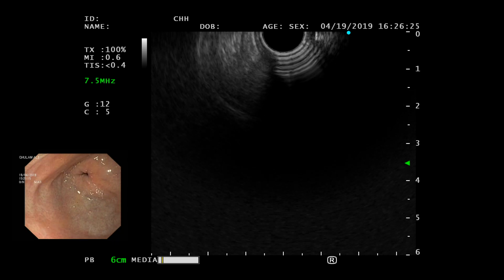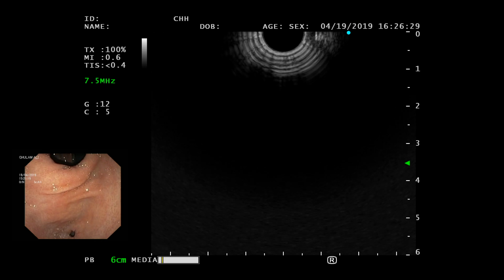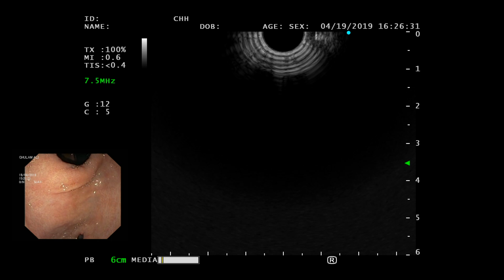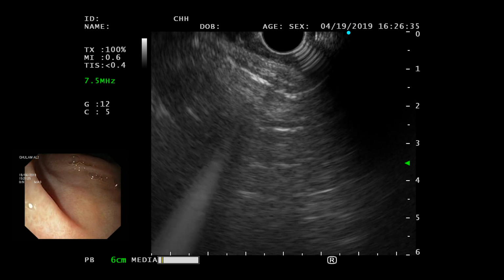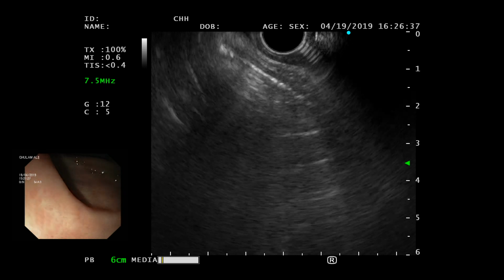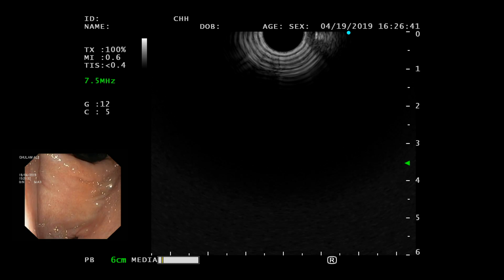Big wheel towards you. Yeah. Good job. Excellent. The wheels are unlocked, right? Okay, fine. So go open in. No, it's open, no problem. Yeah, this is open. So when you see the opening even a little bit, that's open. So come back a little bit. So you have to angle that. Yeah, okay, you have to bring it down.